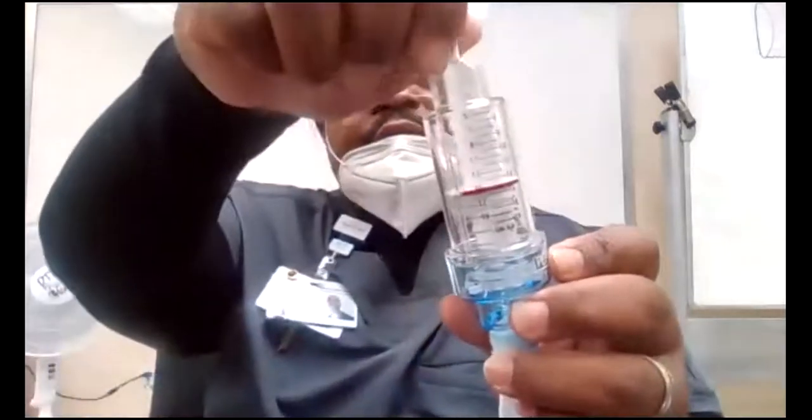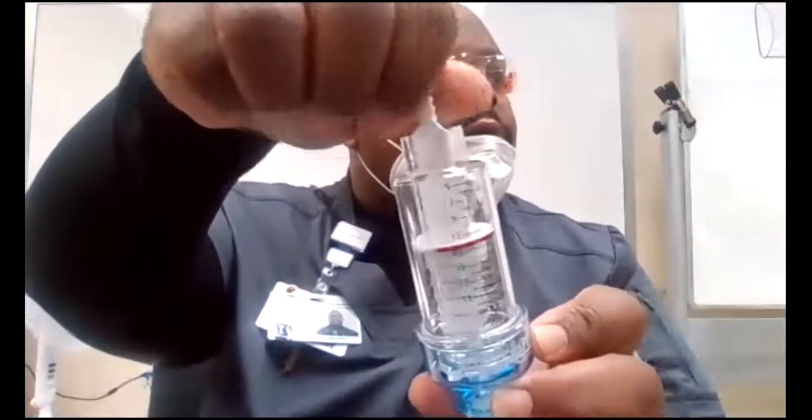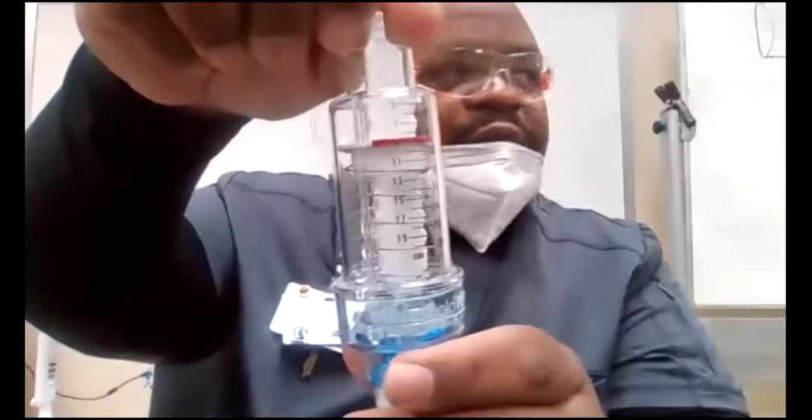Same thing. Okay? Positive expiratory pressure. So when you expire, it's giving you some positive pressure back into your lungs. You can control this at different centimeters of water. Whatever the doctor's orders, that's what you do. If it's too much, you back off of it some, right? So I can use it too.